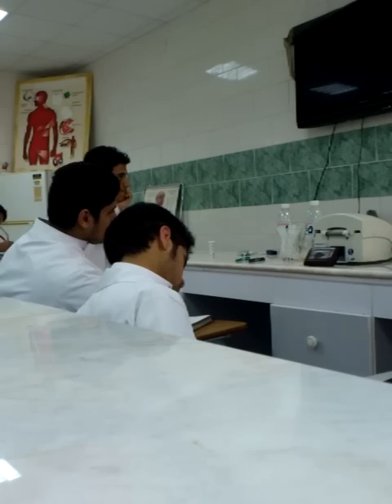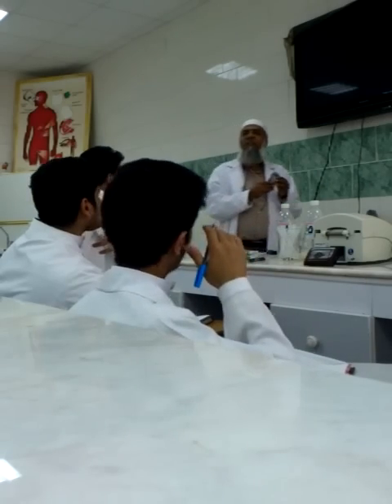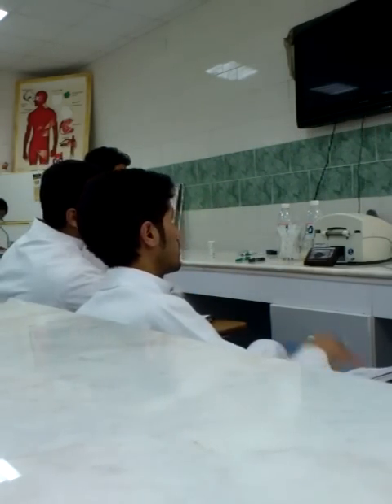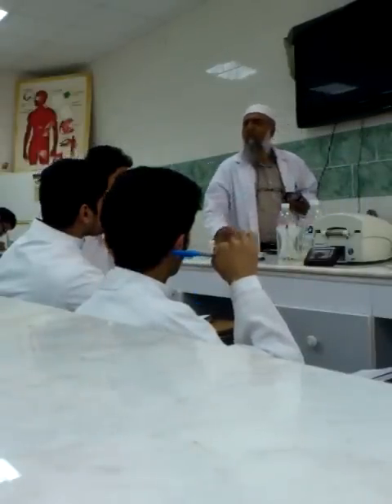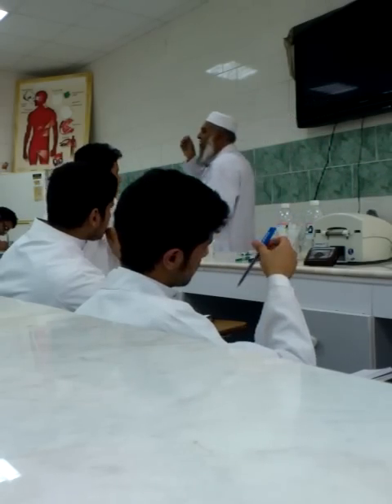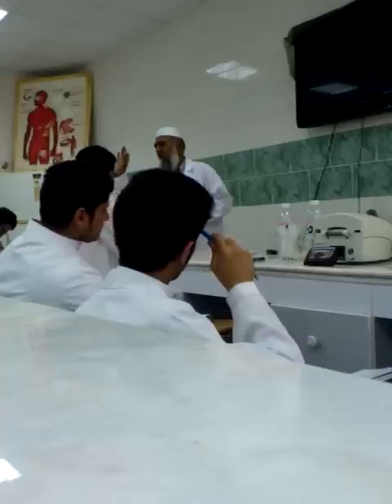Whenever there is something wrong in your procedure, the letter E will appear on the screen, and it means that your procedure is wrong, something is wrong in it, and you cannot get the glucose value. So that's why if you do not cover the colored area properly with the blood, the letter E will appear on the screen and you will not get the proper result. Okay?